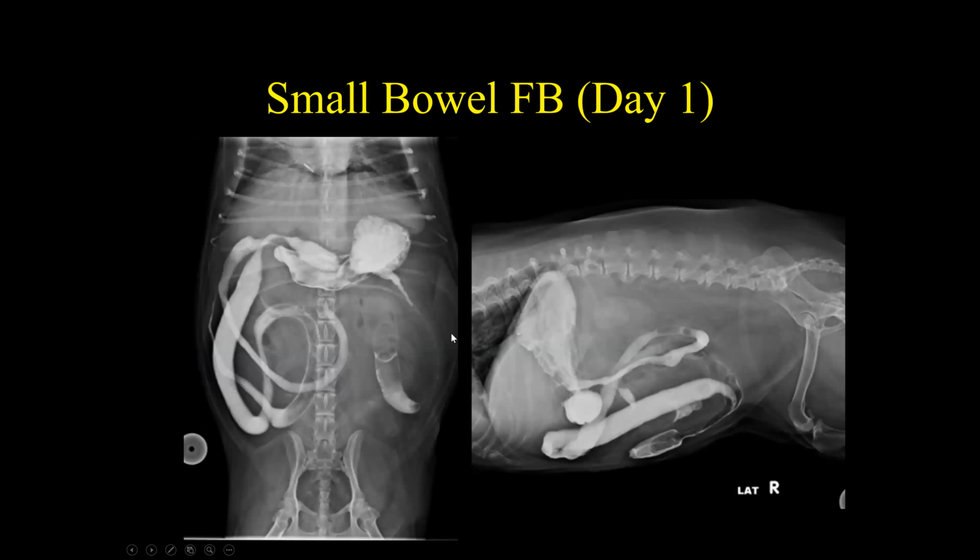Okay, here's an example of an animal that's obstructed. Here's barium in the stomach, going through the small bowel, and then we get down to this portion of the small bowel, and this area of small bowel is significantly more dilated than this small bowel. And you also note that this is the diameter of the bowel, and it's much greater than the height of the vertebral body. So it's too big. We've already learned all that.